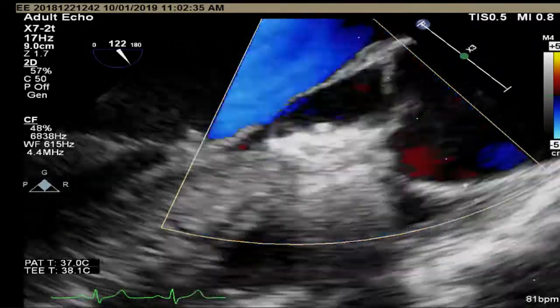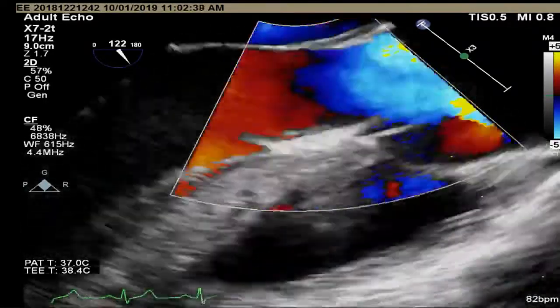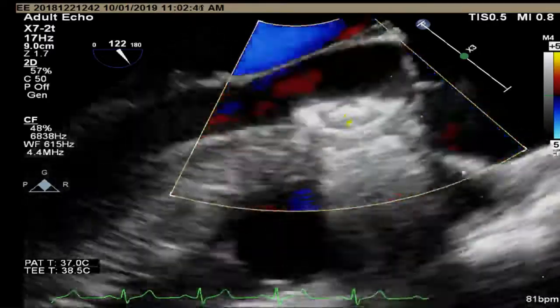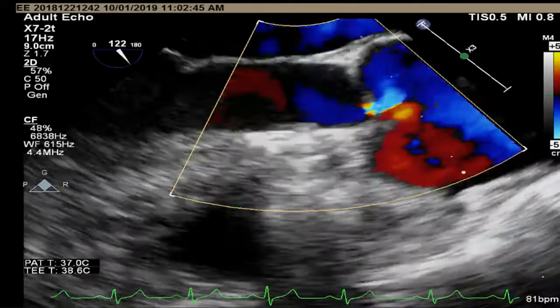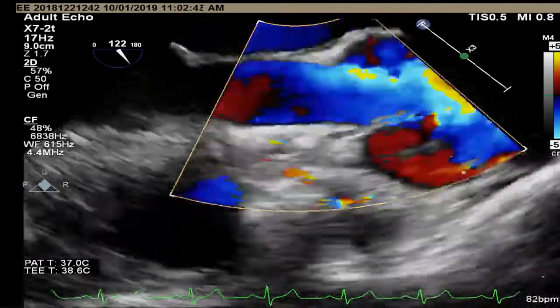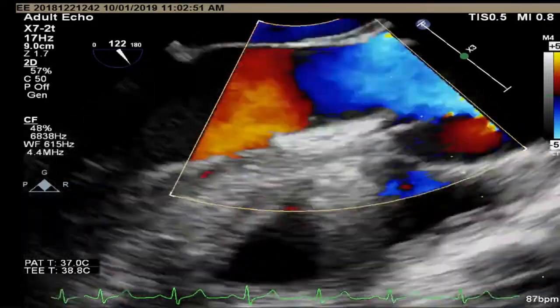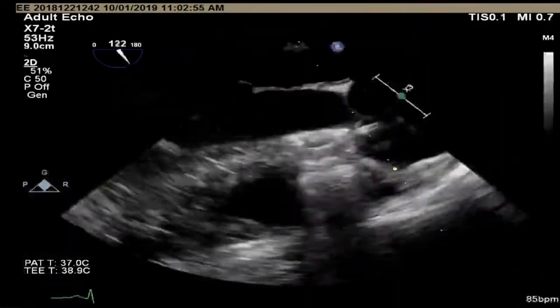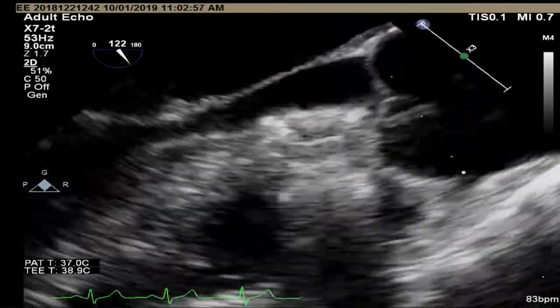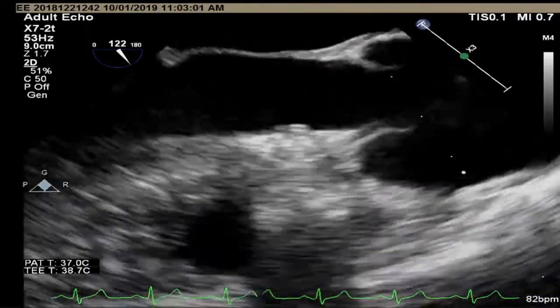You want to downsize it? Yeah, I can. No, I'm not keen on an aortogram. Maybe I can do an LV angiogram. There is no AR at all, so an aortogram is not going to be of great use. Okay, I'll do that now. Two angiograms, one for the aortogram and then one for the LV angiogram.